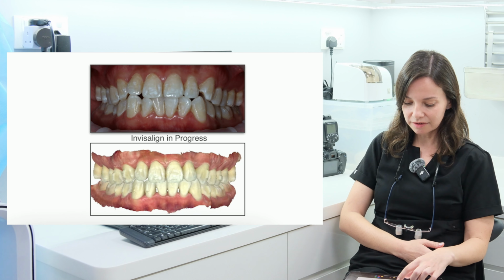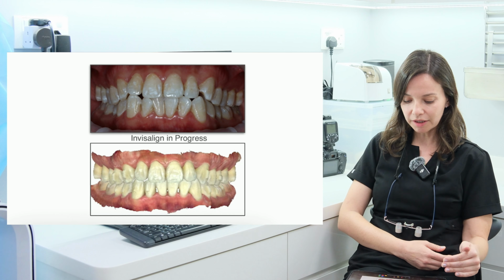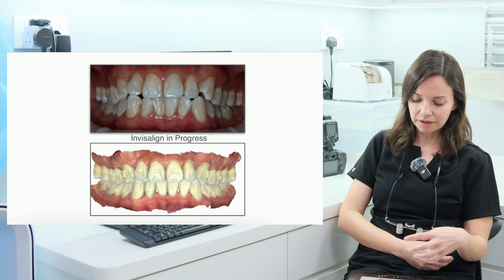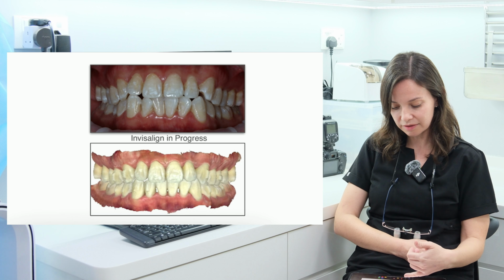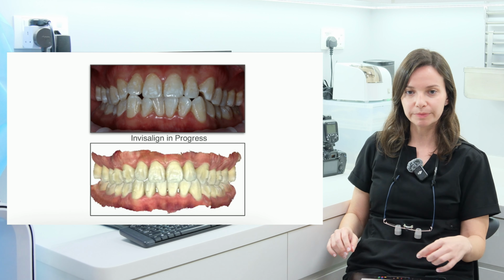Moving on, this is another case where there's a bit more crowding on the top and the bottom, and this case is going to take a little bit longer because of some of the issues with the bite. However, it's very straightforward, and you can see this is a case that's in progress, and already there's quite a lot of movement.